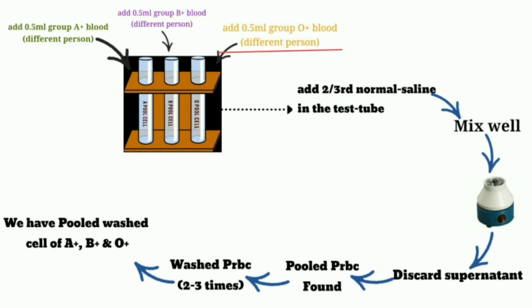Then, after this process, we add two-thirds normal saline in each of the test tubes, mix well, and after mixing, centrifuge at 1,500 rpm for 2 to 5 minutes. When we centrifuge it, we discard the supernatant — by inverting the tube or with the help of a pipette. The supernatant here means the normal saline. When we discard the supernatant, we have only pooled PRBC remaining in the test tube.